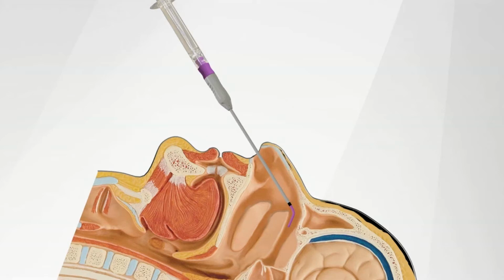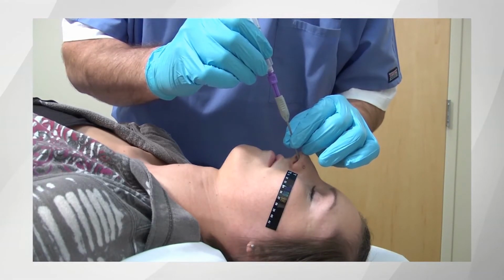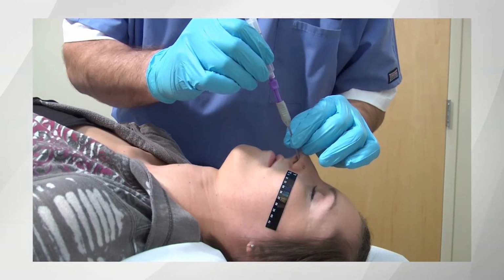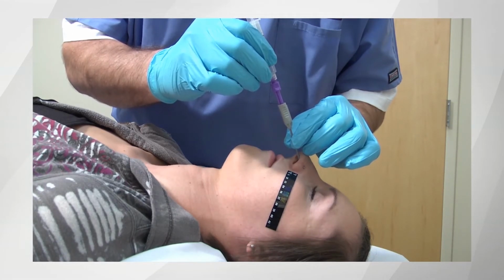Now the SphenoCath is in position to inject 1.0 to 1.5 cc's of 2% lidocaine. At this point, inform the patient that you are now delivering the medication. A brisk, slightly pressurized delivery of injectate enhances procedural efficacy. If the patient sneezes or coughs, pause until they are done.